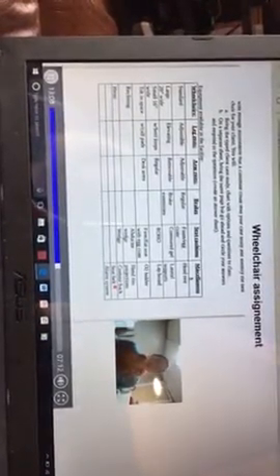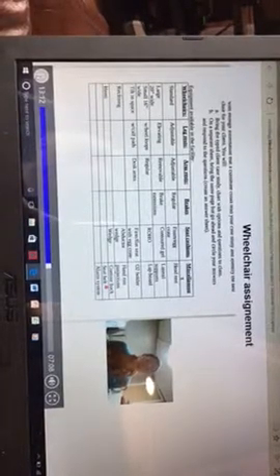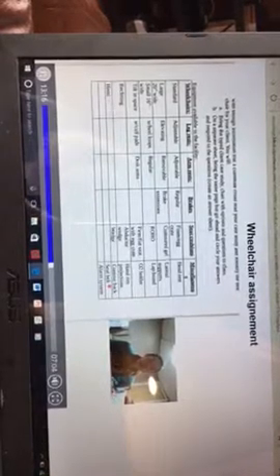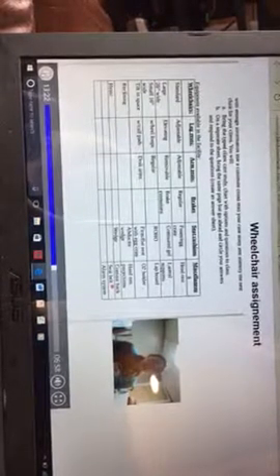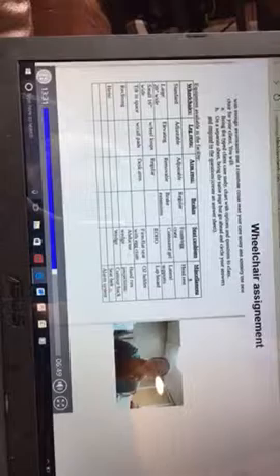And the real important thing with a seatbelt is, especially if it's a power chair or even some wheelchairs, if they're going pretty quick on a hill and hit a bump in the sidewalk and their wheel catches just the right way, it will eject them out of their seat. And it can be really, really detrimental. So seatbelts are pretty crucial for the community-dwelling person who uses a wheelchair.